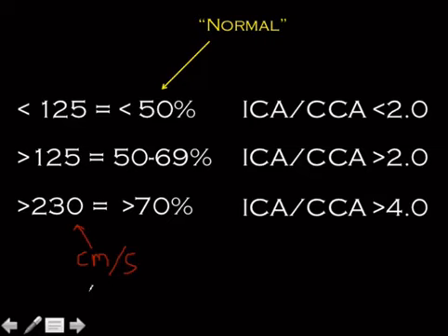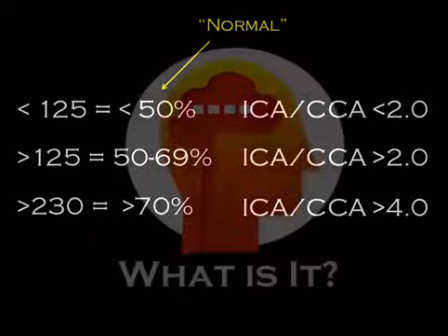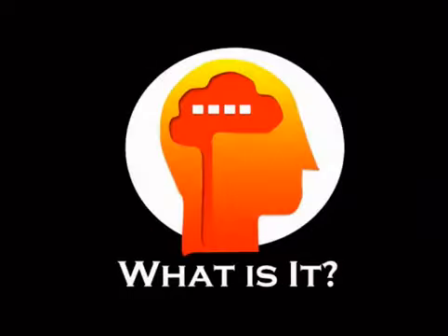So there could be trickery with those numbers in a deliberate attempt to trick you. The other thing is that this measurement is a peak systolic velocity. It's not a mean systolic. You don't care about the average. You want to know what the highest part of the jet is. So it's peak systolic velocity. Multiple choice could show some trickery there.